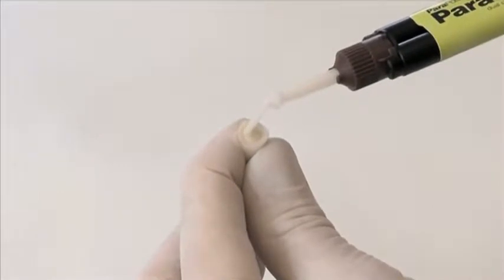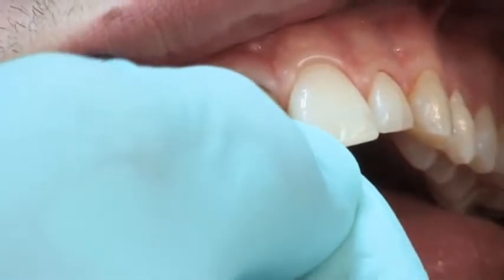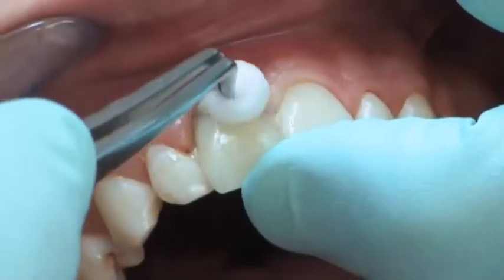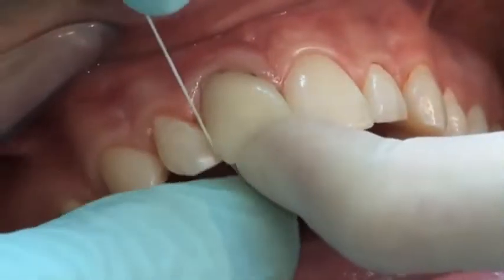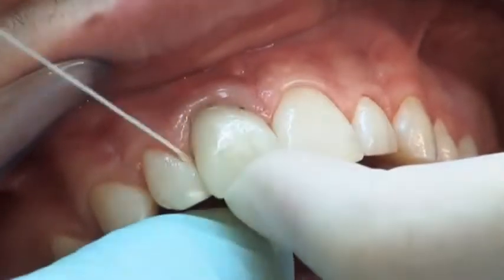The application of ParaCore for the cementation of posts, restorations and core build-ups guarantees an optimal monoblock bond interface between the post, cement, dentin and crown, resulting in one cohesive restoration with outstanding durability and strength. The restoration is held into place with increased pressure and the excess cement is removed afterwards.